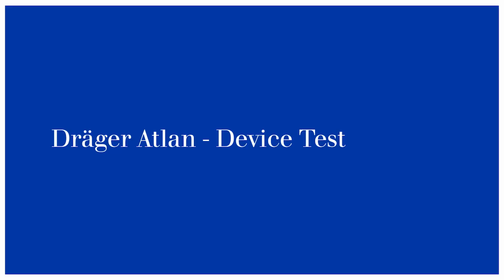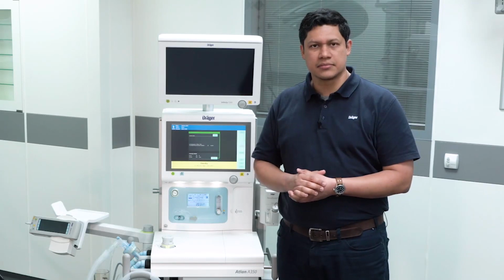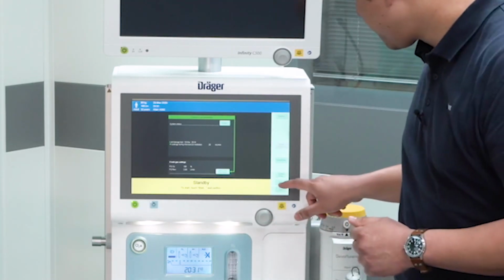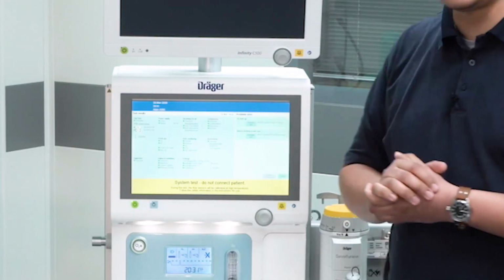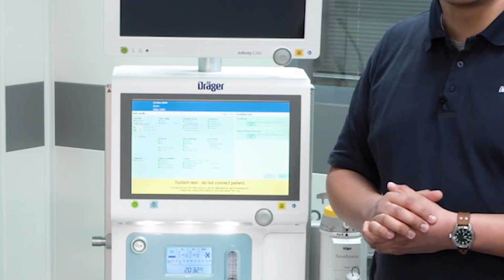The objective of this video is to show you how to run the system test on the Atlan family devices. While you are in the standby screen, just go to the test button and you will have the available test procedure. In the first position, the system test, and in the second one, the leakage test.